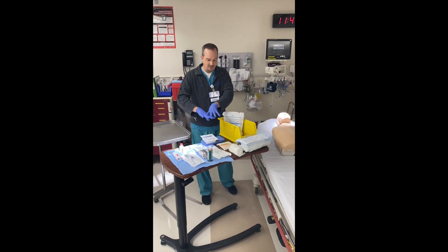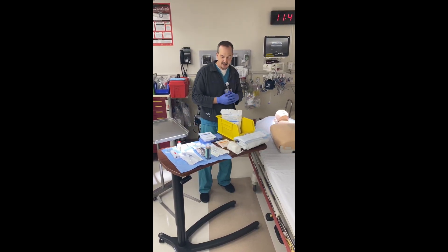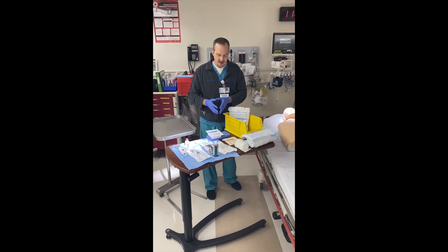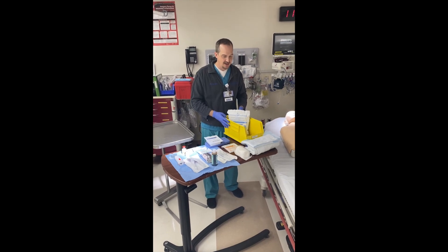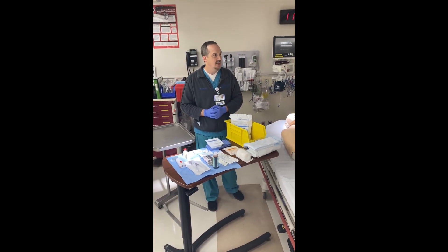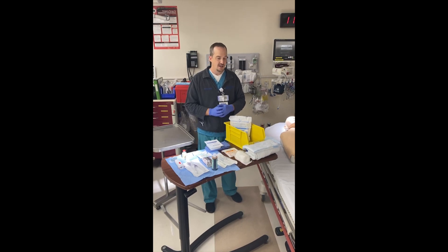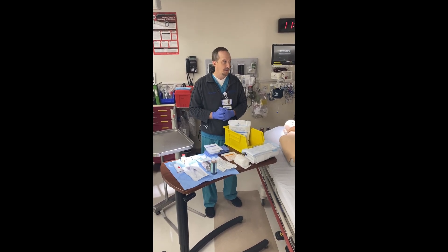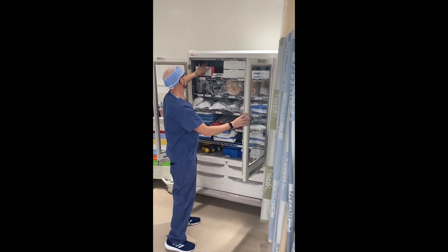What we have here is some of our pre-prep materials — things we have to set up with our patient. We want to make sure that you gather some of this equipment beforehand, which will typically be in a box or a container, a to-go box. In one of the cabinets in the trauma bay, we also have three things that are usually needed for us to do the sterile procedure. Those three items are in the top cabinet over here.